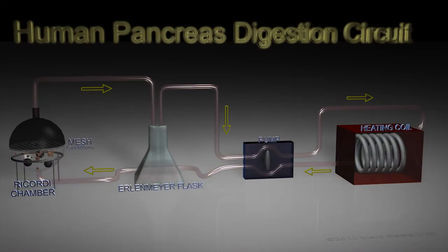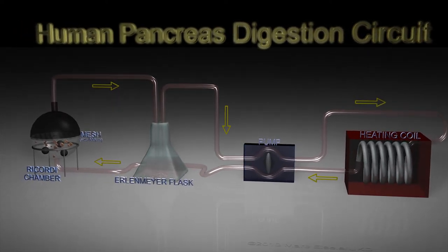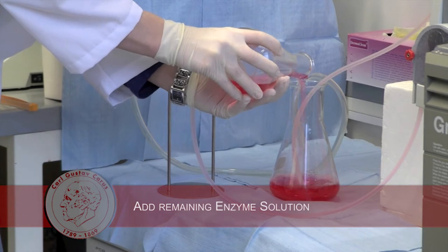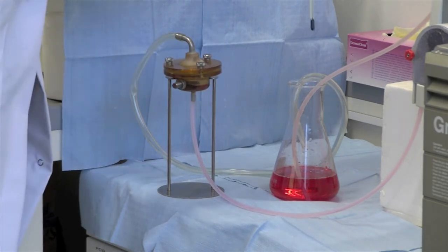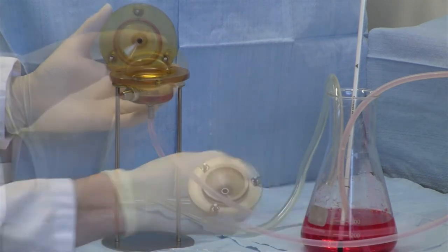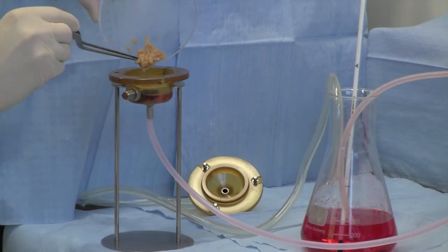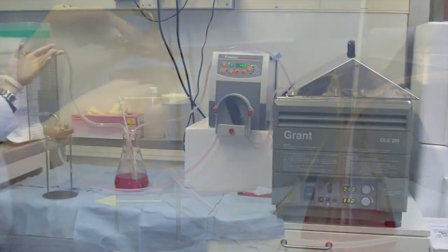In parallel, we assembled the digestion circuit as shown in this figure. The flow direction in the Ricordi chamber is in at the bottom and out at the top of the chamber. Afterwards, we add the remaining enzyme-containing media to the 500 ml flask up to a volume of 300 ml and then insert the thermometer. The Ricordi chamber contains a metal mesh with a pore diameter of 600 µm and 3 silicon nitride marbles with a diameter of 15 mm each. We transfer the pancreatic tissue into the chamber, insert the mesh, close the chamber, and start the pump with a speed of 140 ml per minute.